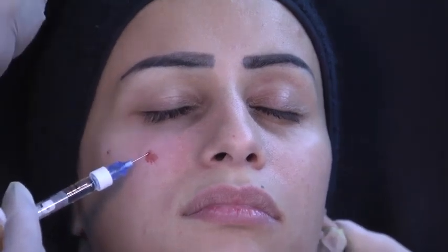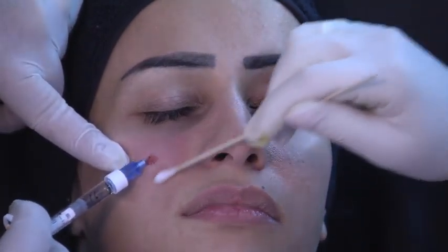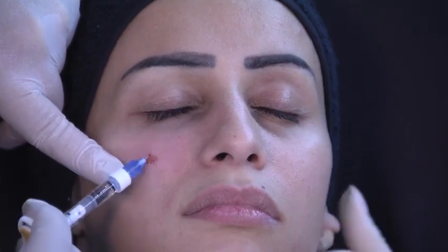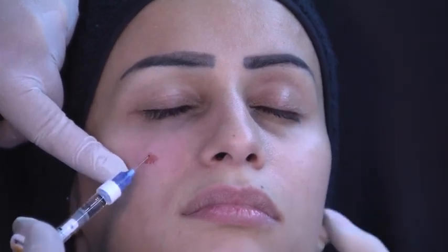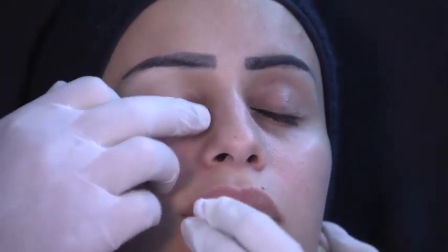Only inject the deep area, but I have found that injecting just a drop, look what I'm going to do now, just a drop in the superficial part, it's just a drop. I'm not even moving the cannula. It can improve the dark circles a lot. And it's very easy to mold because remember, this is Vital Light. It's just a drop, less than 0.1.